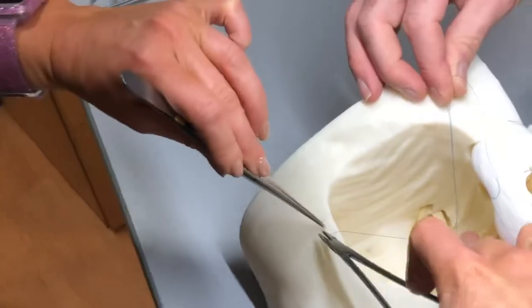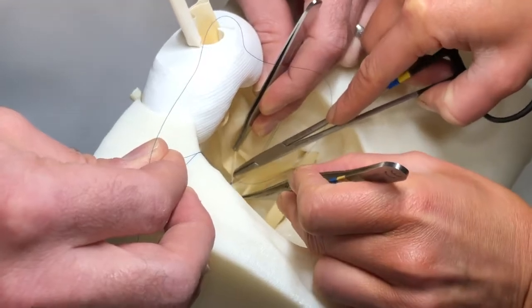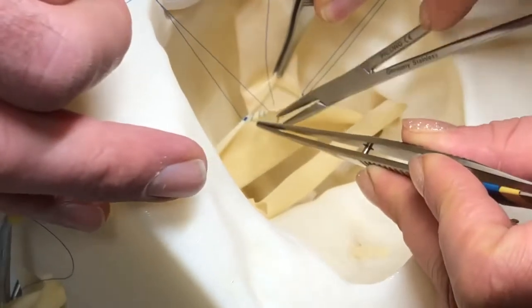Following a blind back wall stitch, the back wall of the anastomosis is run. For this anastomosis we used 5-0 prolene. These do not need to be tiny bites as there is a lot of room during this part of the anastomosis.